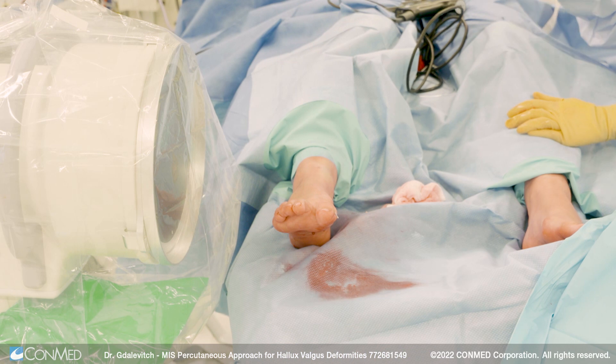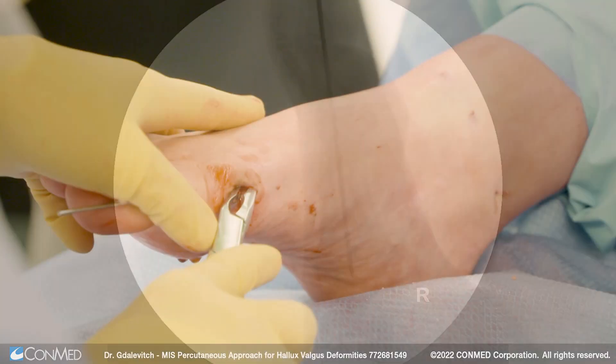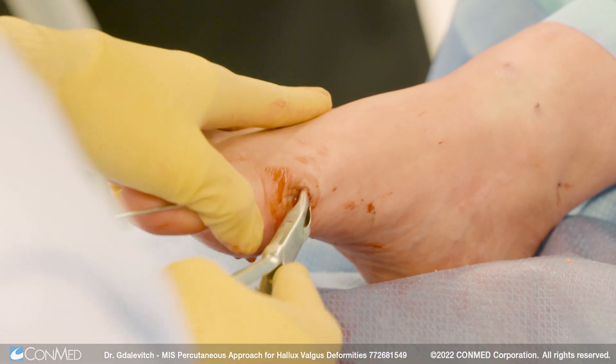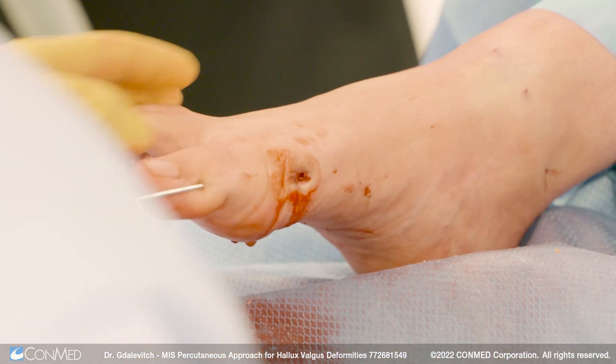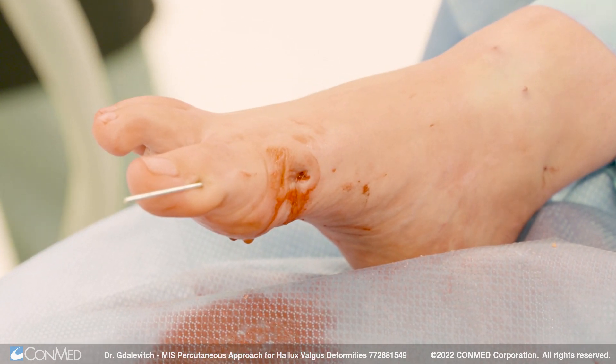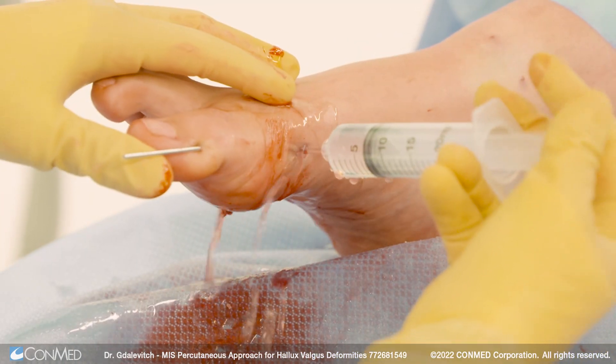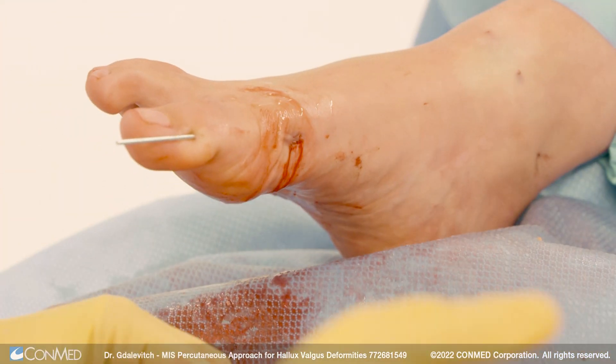On the lateral x-ray, that's a perfect lateral. The wire is centered in the metatarsal head as well as into the metatarsal shaft. The final step is removal of the small amount of medial bone that's on the proximal metatarsal portion. This is just to make sure that the patients are comfortable in shoe wear. A little bit of irrigation is done to remove any little bits of bone left, and a dissolvable stitch is used to close the skin.